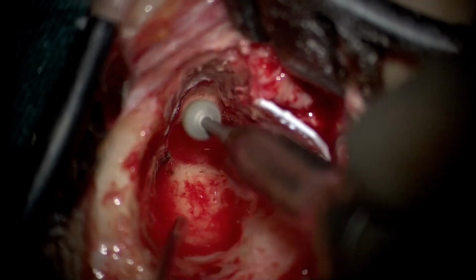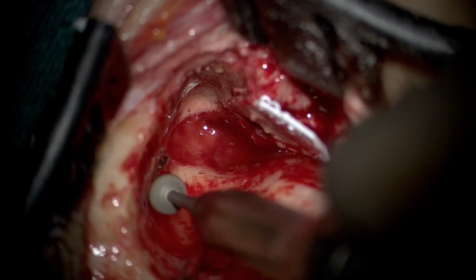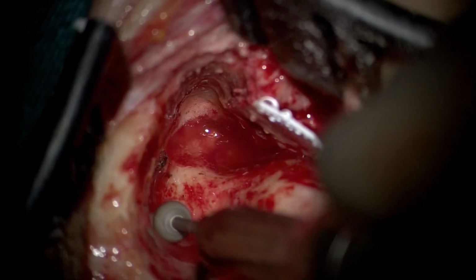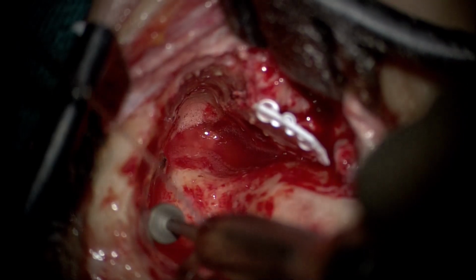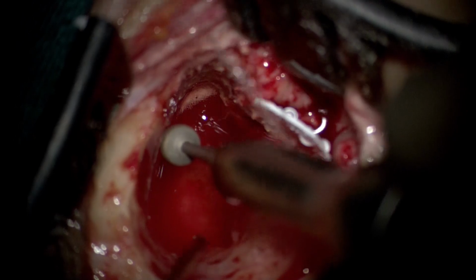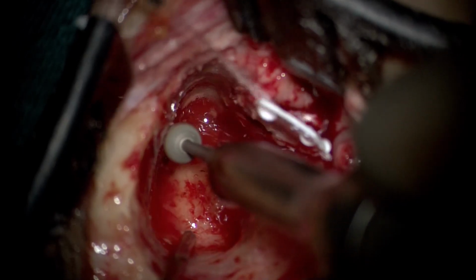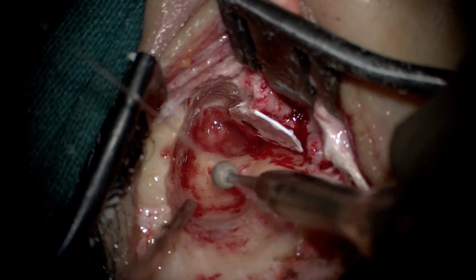So once that has been done, we again resort to opening the anterior epitympanic recess slightly more widely, because we want the cavity to be saucerized. For this part, we use a large diamond burr to saucerize the cavity, while also keeping in mind that we do not want a very large cavity, but good saucerization helps in reducing the overall cavity size, because it lets the soft tissue of the post-auricular region fall inside with relative ease as compared to a standing tall mastoid cavity. The diamond burr also helps in achieving hemostasis over this region.